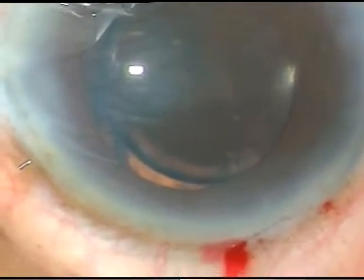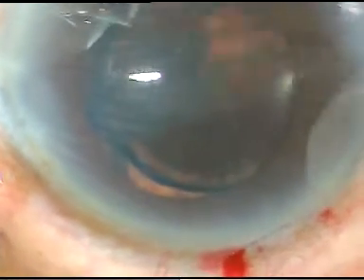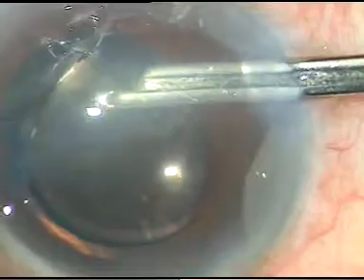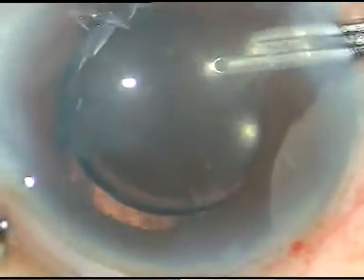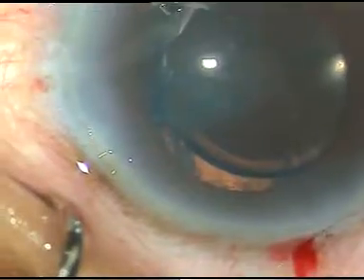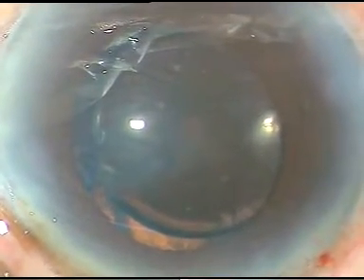I take a Simcoe cannula, at this time a 23 gauge Simcoe cannula, and I try to remove this cortical lens matter. But it was not coming nicely. I'm thinking what to do.